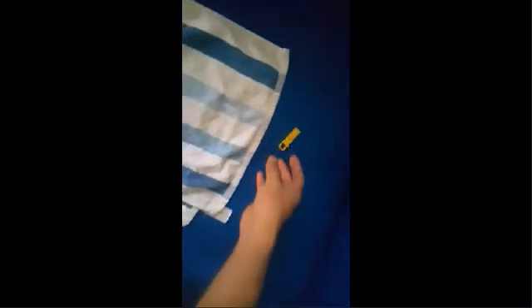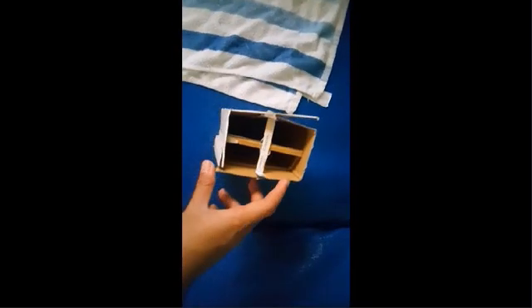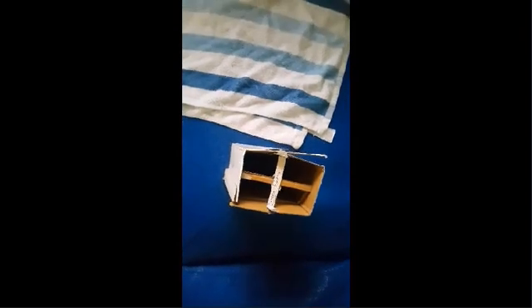And for the SID, same lang din sila, which is 72 inch SID as a minimum para ma-decrease ang magnification of the heart and to increase the recorded detail on certain thoracic structures. And for my final return demonstration, I'll be using my face towel as my gonad shield, then my USB as my marker, and then my collimation box for the central ray and beam. And I will also be using our refrigerator as my vertical grid device and image receptor.